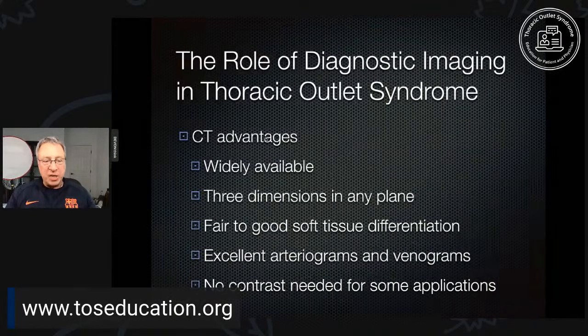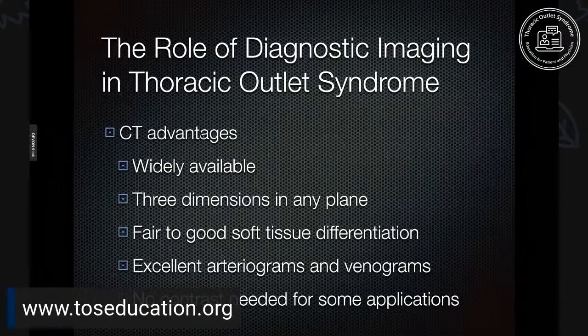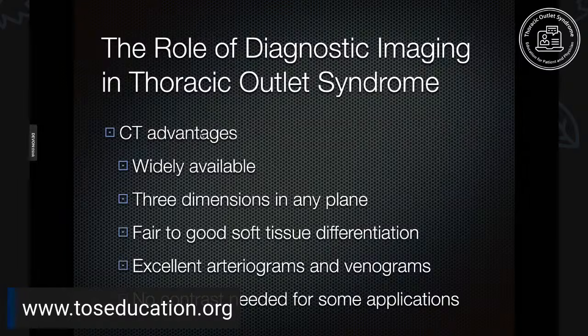So the advantages of CT are it's widely available. It's available in most hospitals and emergency rooms. You can see all 3 dimensions in any plane that you pick. Once you acquire the images, you do what we did on some of these earlier images: you stack them together in different directions and you manipulate that data to create very nice pictures.